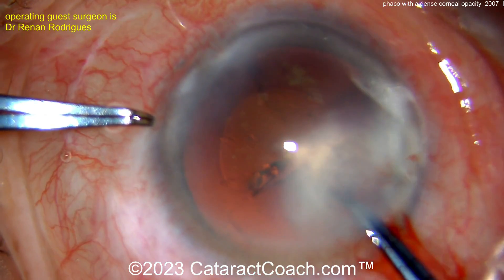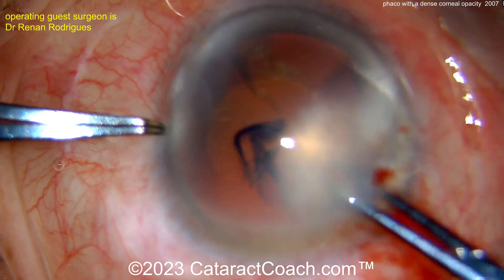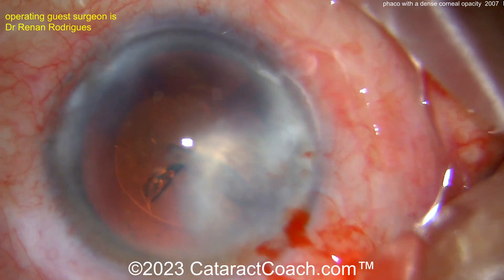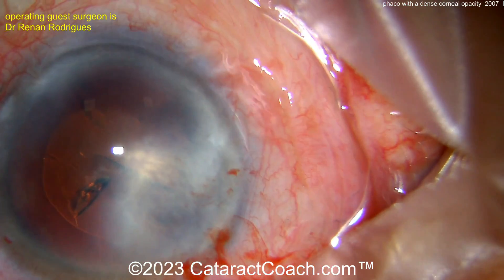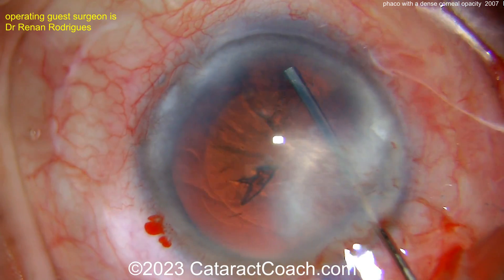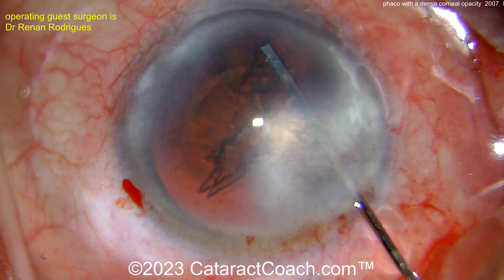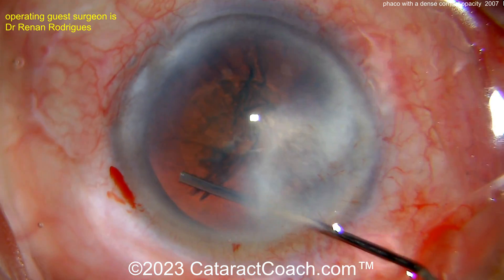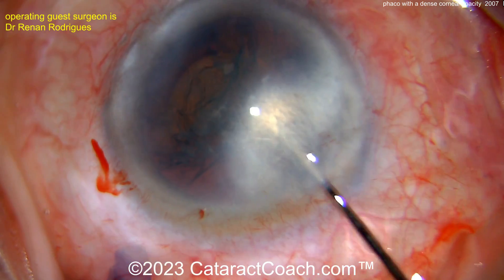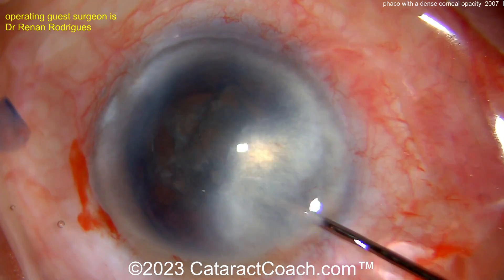The Trypan blue dye is helpful to improve visualization, especially in a case like this where almost half the cornea is obscured by that dense corneal opacity. There's a nice-looking rhexis. On a case like this, I like to get the lens nucleus out of the bag in order to emulsify it. The reason I do that is because the cataract is not very dense, and also I want to stay away from the capsule — you're going to have a hard time visualizing the capsule. If you're an experienced surgeon, you can still operate within the bag and safely remove the nucleus.